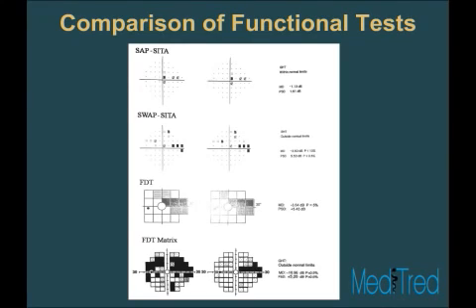So comparison studies have shown that each of these tests can identify glaucoma a little bit better in different patients. And by combining more than one test in someone who's very suspicious for glaucoma, you then further increase your sensitivity to detect disease.